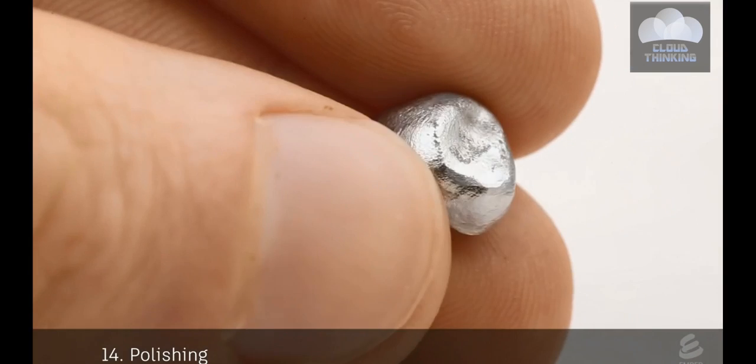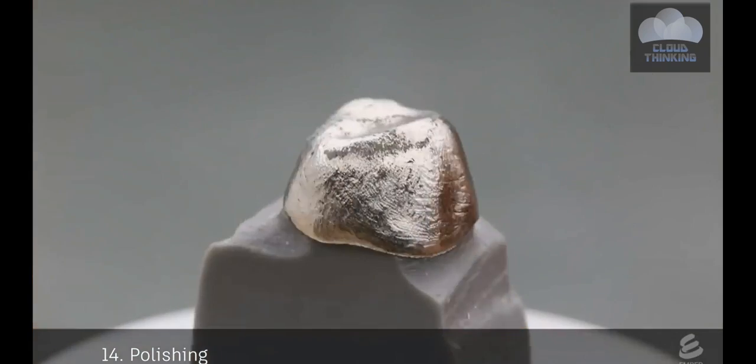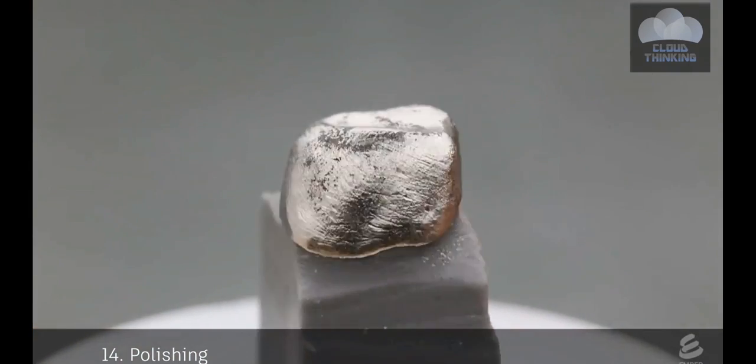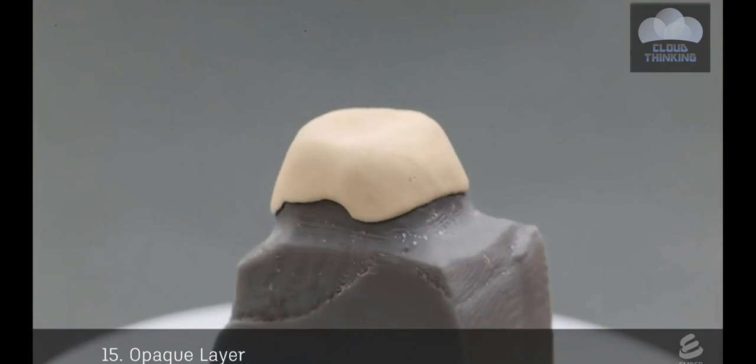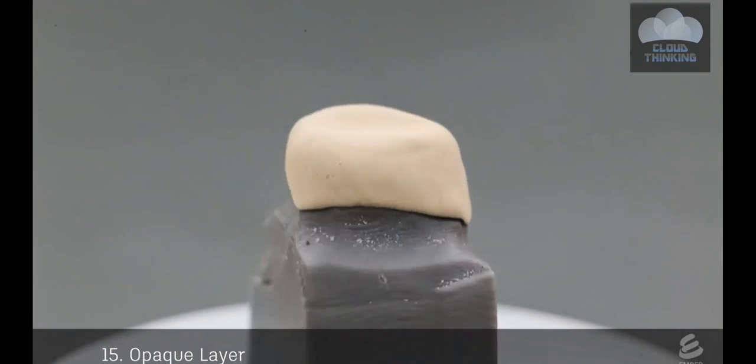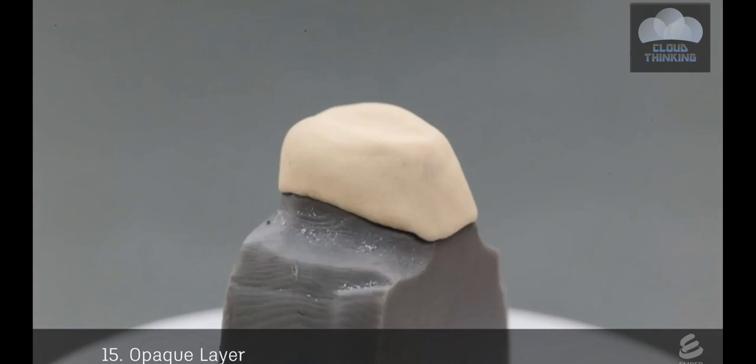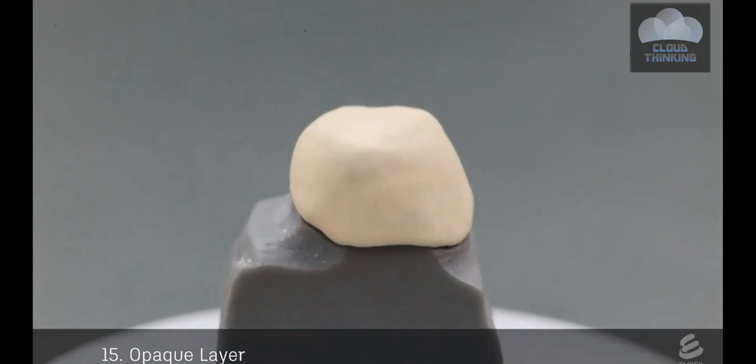These castings then go through a polishing step. This metal casting will form the substructure of the final crown. Next, an opaque layer is applied to the casting. It acts like a primer. It covers up the gray color of the metal and also increases adhesion with the porcelain layer.